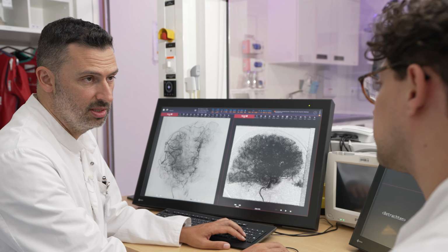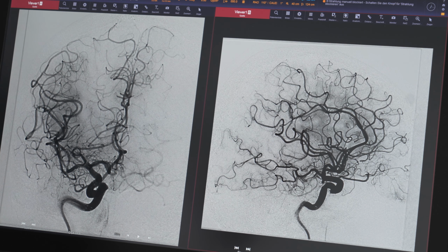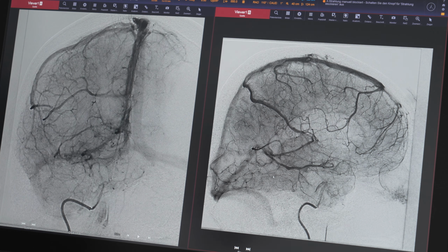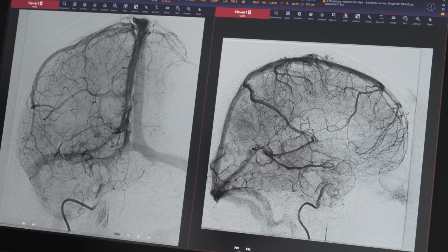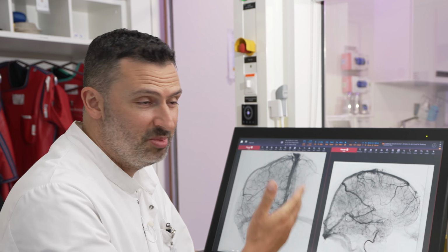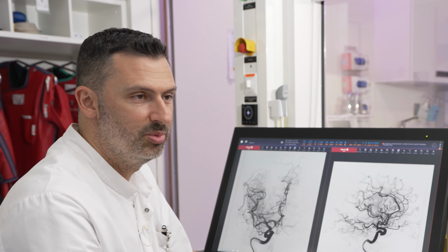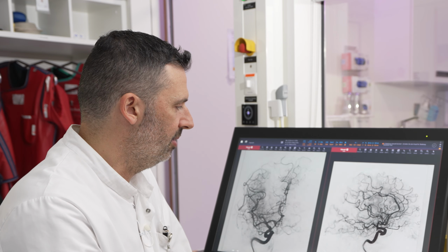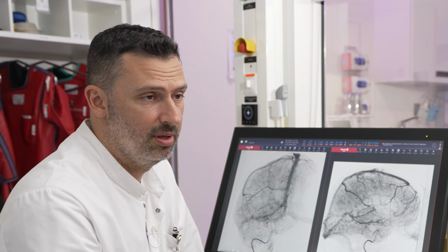Actually, for the superior trunk it is a TICI 3, obviously, and then you can see the occlusion that was there before, also as we discussed, in the M3 of the inferior trunk. We gave some TPA for this occlusion, but we decided against going with mechanical means so far into the brain at the moment. This is maybe something for the future, but I think until now we need to have evidence for M2 occlusions. We have this evidence now, and regarding the M3s, we will see in the future if we're going to do that with mechanical means. It didn't open with TPA.